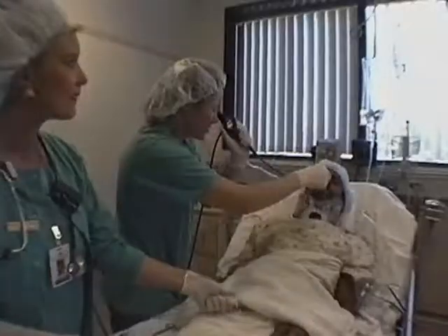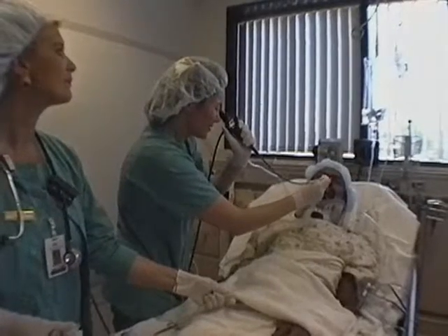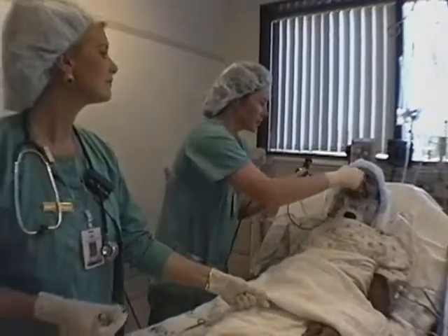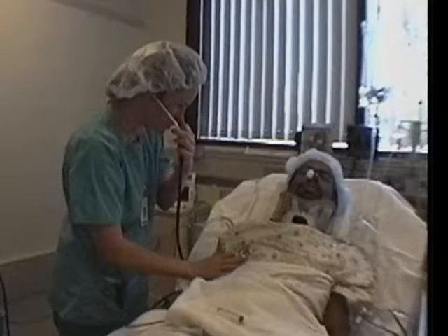Look through the fiber again to verify that you can still see tracheal rings.